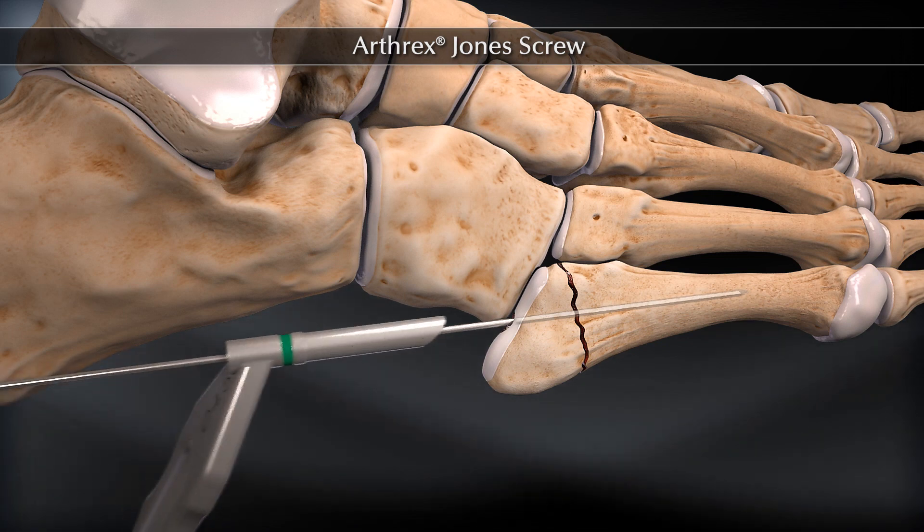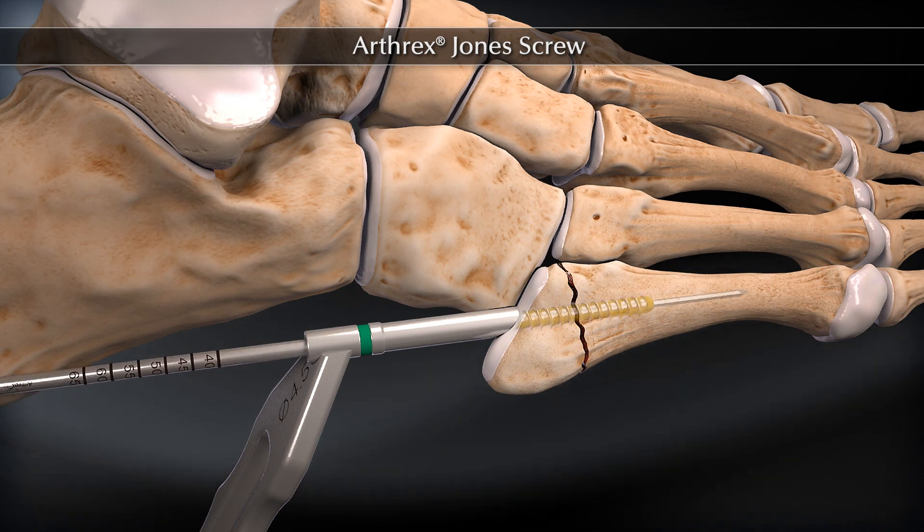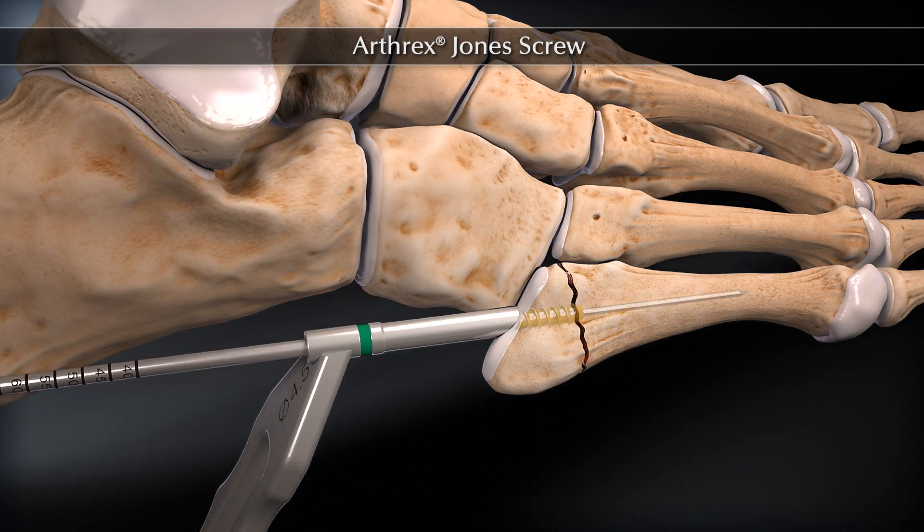Using the cannulated tap and drill guide, tap to the intended length. The tap should feel tight within the intramedullary canal distal to the fracture site.